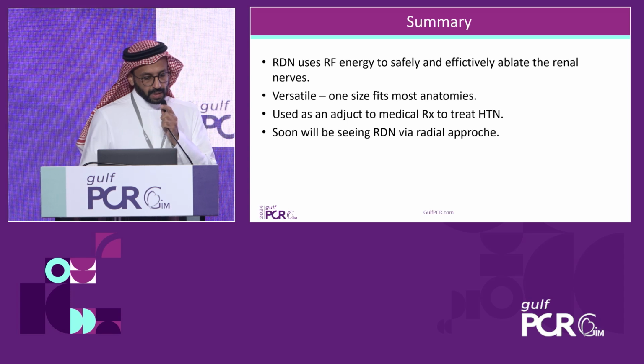So in summary, renal artery denervation is a radiofrequency system, and it's safe and effective. It has to be combined safety and effectiveness. Renal artery denervation is versatile. It's one size fits almost all based on this new design. And it's used as an adjunct to therapy, never as a standalone, never as a first line.